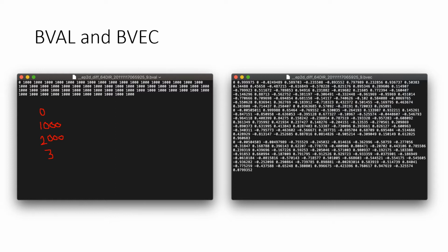But that will help us when we're reconstructing the diffusion of water in the brain, even with a simple, or call it simple, but a more simple model of diffusion tensor imaging that we went over in the previous video, the slides. So even with that, it will help to have multiple b values. And so most of the newer research scans typically are acquiring multiple b values now.